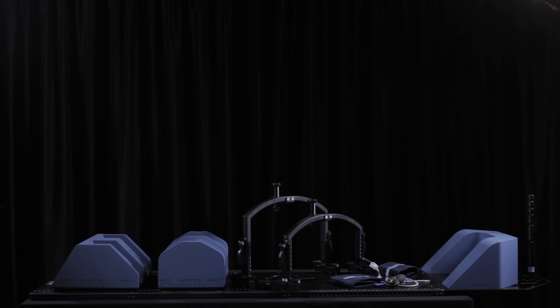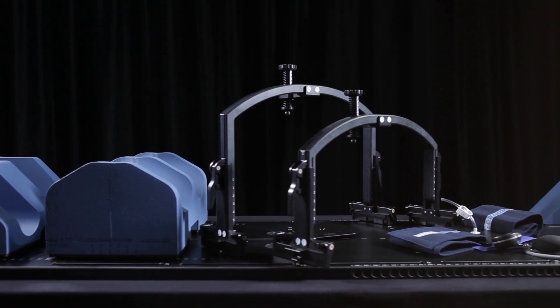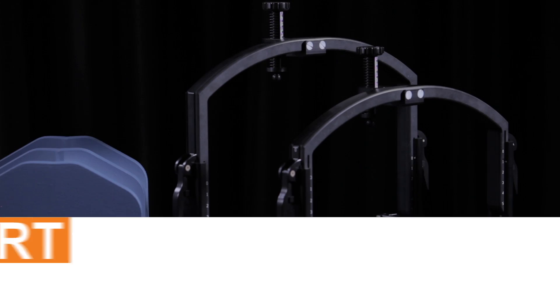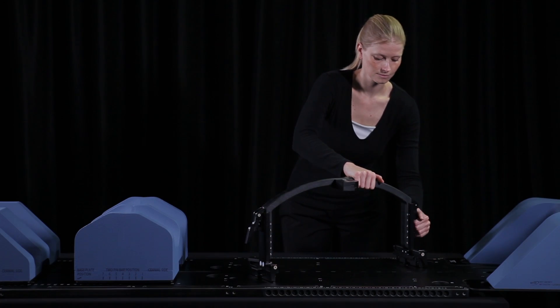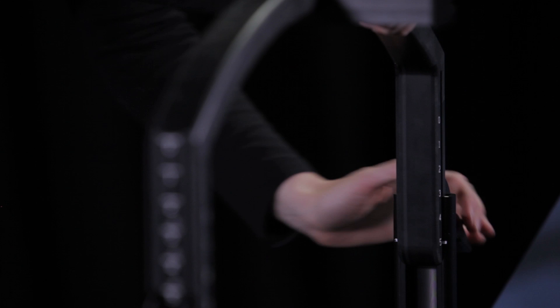The Orfit SBRT solution has two different abdominal pressure devices: a mechanical pressure system and a pneumatic pressure belt system. For the mechanical pressure system, you need the pressure system bridge that consists of an arch, a screw and a pressure plate. There is a low and high version of the arch. Move the arch to the highest position by opening the locks on both sides and sliding the arch vertically upwards to position 5.